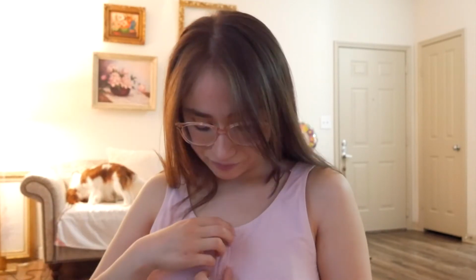I want to show you one thing to take into consideration if you have expanders. Don't look at the shape and think that that's how it's always going to be. It's really about the roundness, the fullness, because the expander actually has ridges in it. So I can definitely see them and feel them in my chest, and at first it looks like bruising. On the top, there's an indent, something I've never seen in my body.